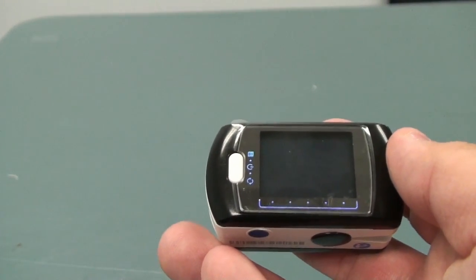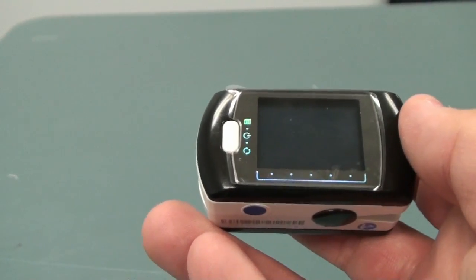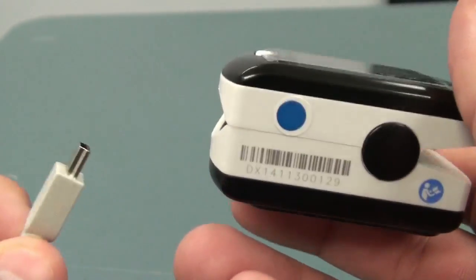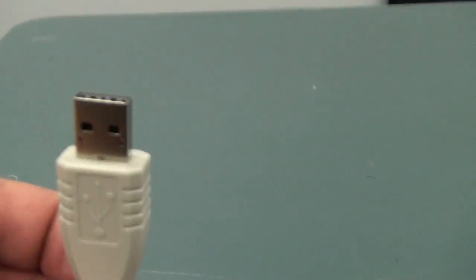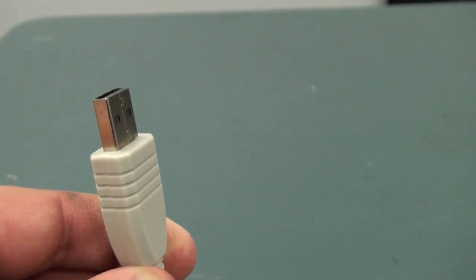The CMS50E is a rechargeable device. The device itself will come charged, but when the time comes to charge it, simply grab the transfer cable and plug it into the mini-USB port. The other end of the transfer cable will be the regular USB. Plug it into a computer and the device will charge.